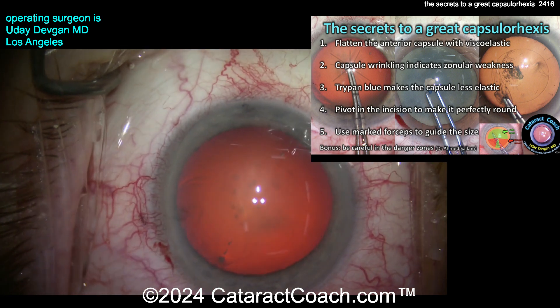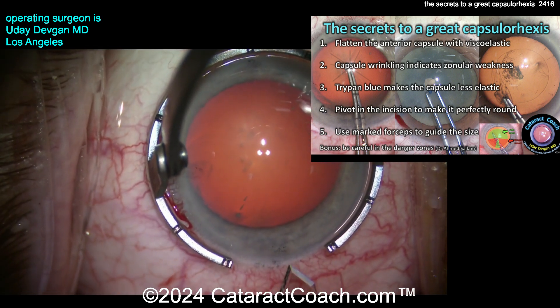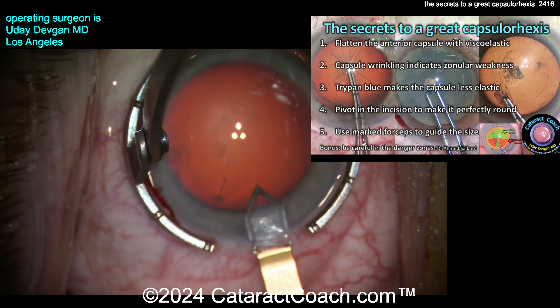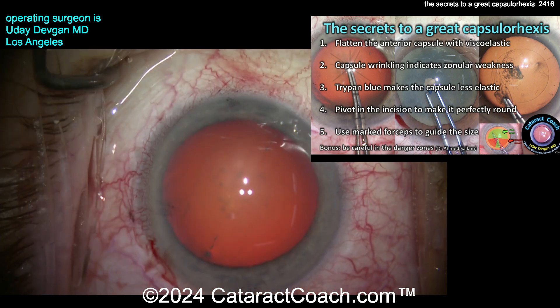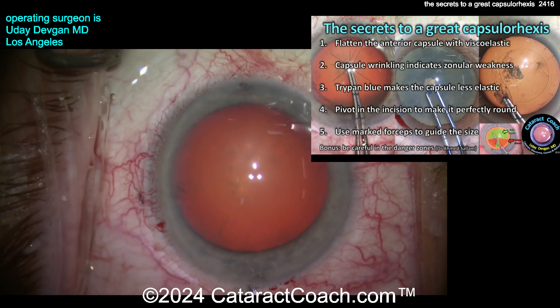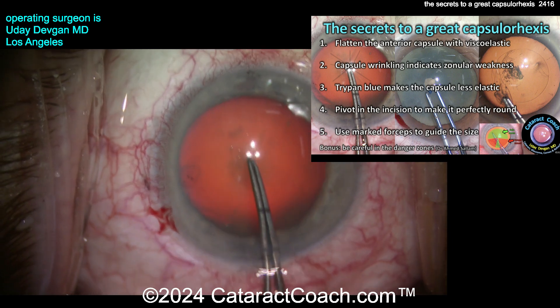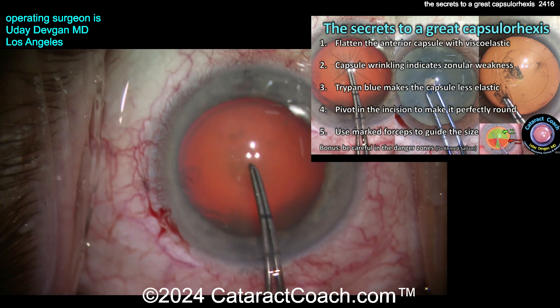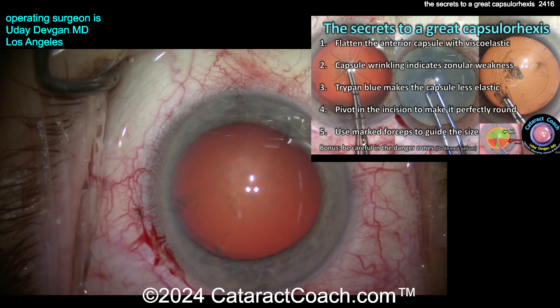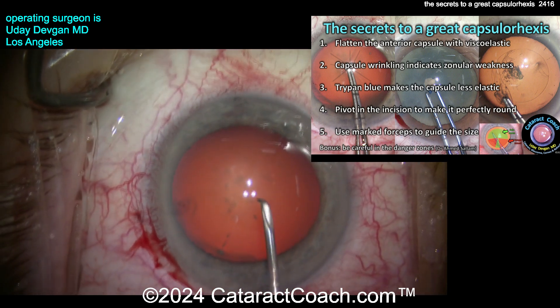Here's another cataract case. Viscoelastic going inside, filling it up, flattening the entire lens capsule. I want a good pressure field — IOP about 20 mmHg. Diamond keratome to make our main incision, then in with the forceps. The forceps are not that sharp, and the reason I like them is they give me a lot of information about the lens capsule. Watch as I go in — I poke in just measuring it out. It doesn't want to puncture; it just wrinkles. I just can't puncture it like I normally do.